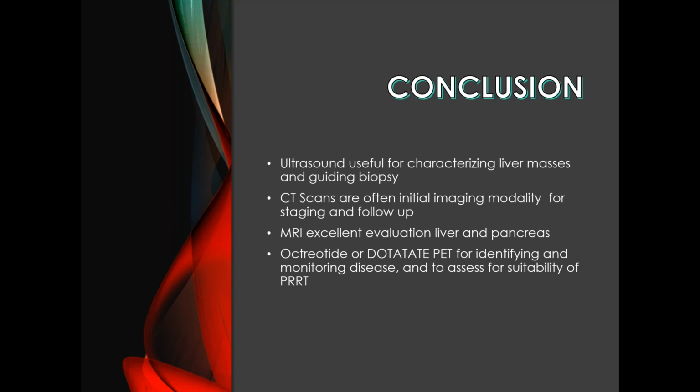Okay, thank you. Next question is, are PET DOTATATE scans useful in follow-up for lung neuroendocrine tumors? And if so, how often? Mm, that's a great question.